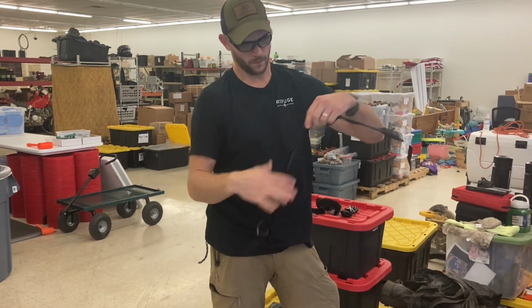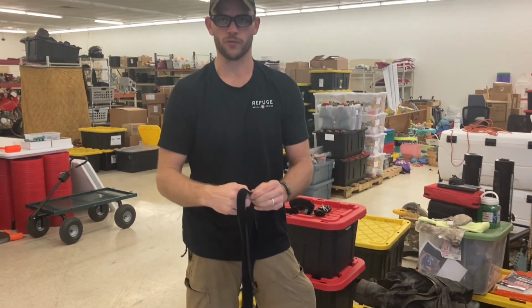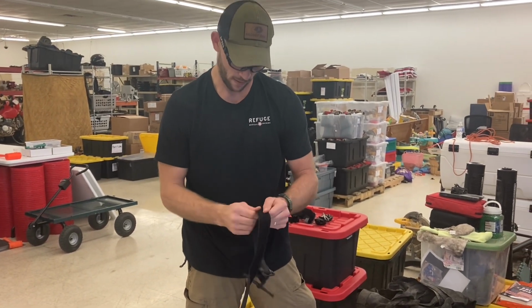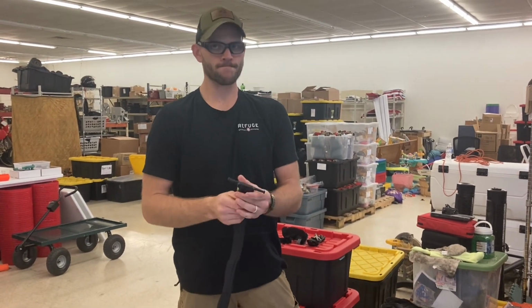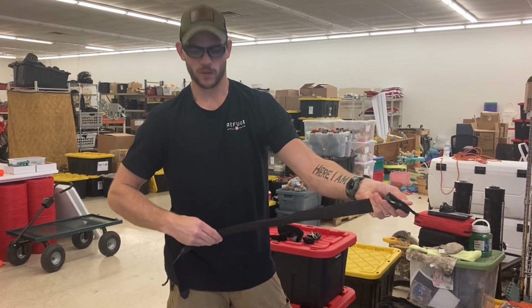Started equally. And this, man, there's no way this would survive a Responder 3 class that we do. It takes way too long to straighten out. But that's a practice thing. Well, as many times as I put a tourniquet on in Responder 3, we average at least 100 per student, at least.